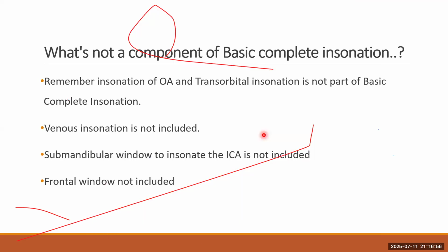So what's not a part of basic insonation? Orbital window, definitely not. Venous insonation, definitely not. Submandibular window, definitely not. There are specific instances where we use the submandibular window, and frontal windows are also very rarely used. Hardly any information.